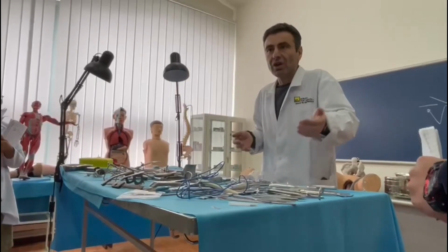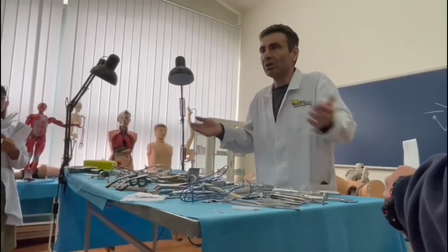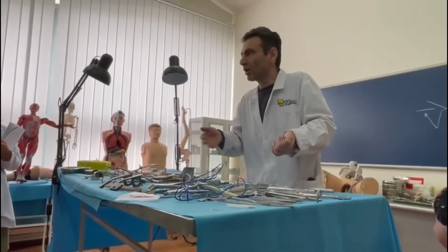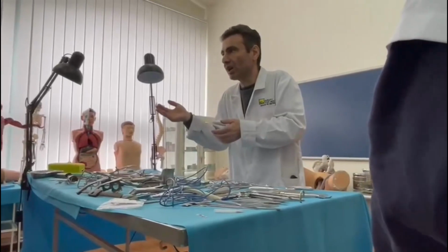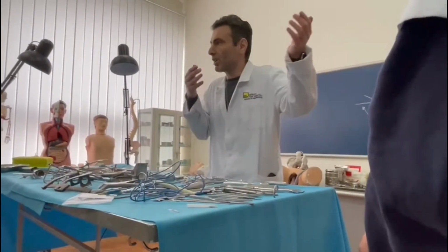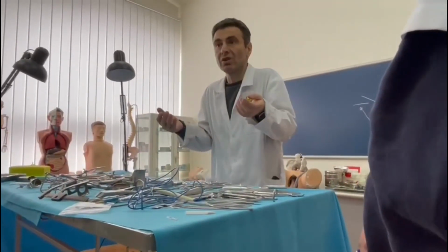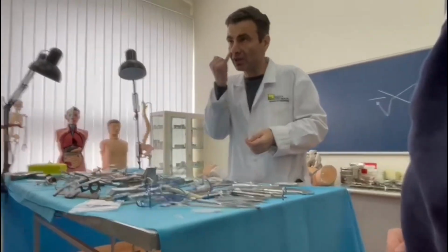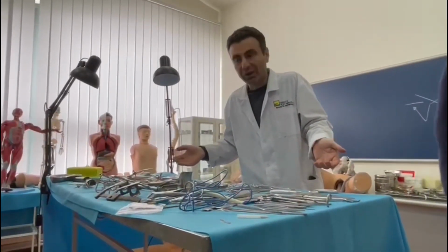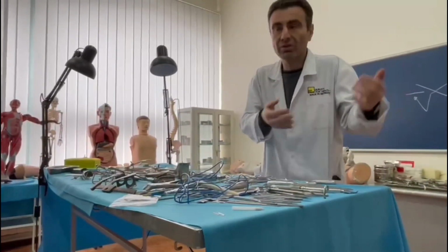It's impossible to imagine any incisional operation without bleeding. There are some special surgical manipulations without bleeding. Let's say we have operations with bleeding and without bleeding, which are called manipulations. For example, if I insert an endoscope in your nose, it will generally not give any bleeding. But if I make an incision, it's impossible to imagine any incisional surgery without bleeding.